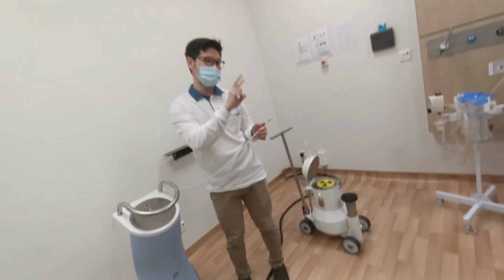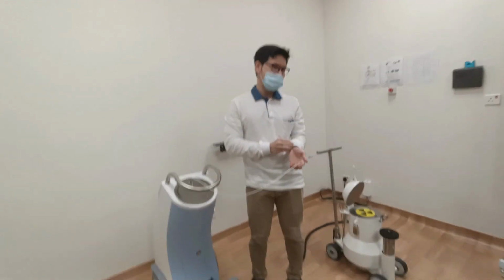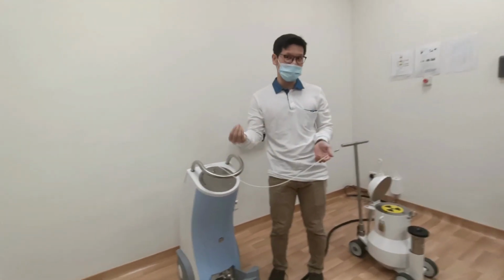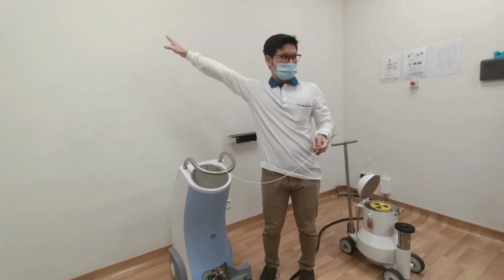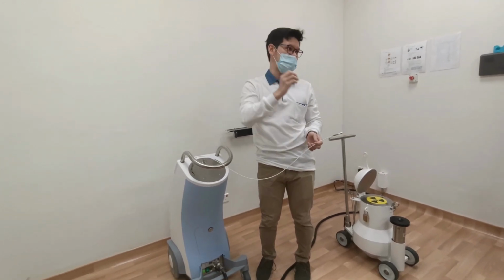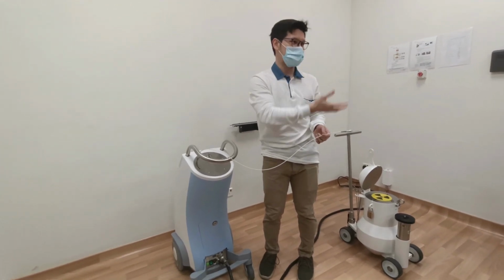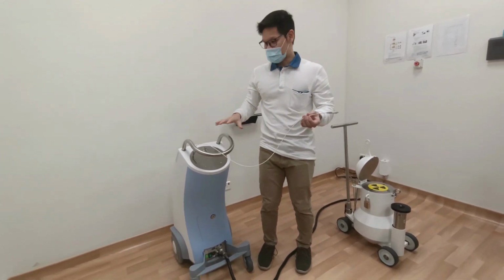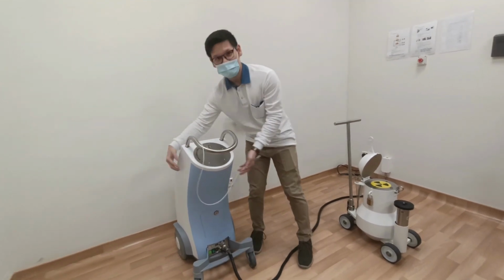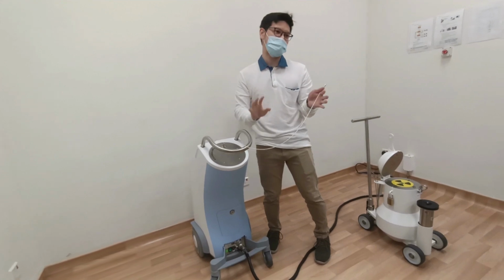There are two types of radiation, some theory. This is a natural radiation source, meaning it comes naturally. It's radioactive. The LINAC that you'll see later, and tomotherapy, are not natural. They are produced by electric electrons. So that one, you can always be near to it. But this one, you can still be near it because it's inside. Out here, there's no radiation. But when it comes out, you don't want to be near it.